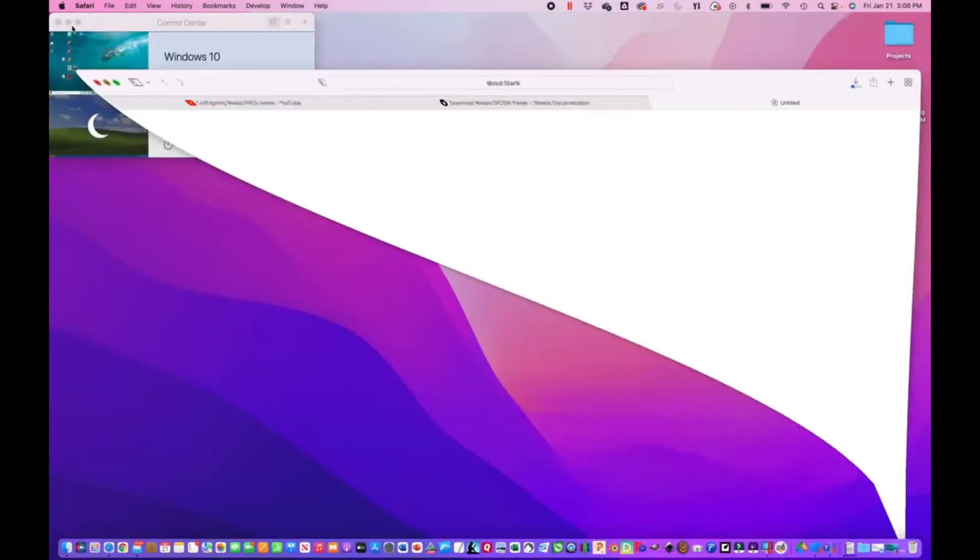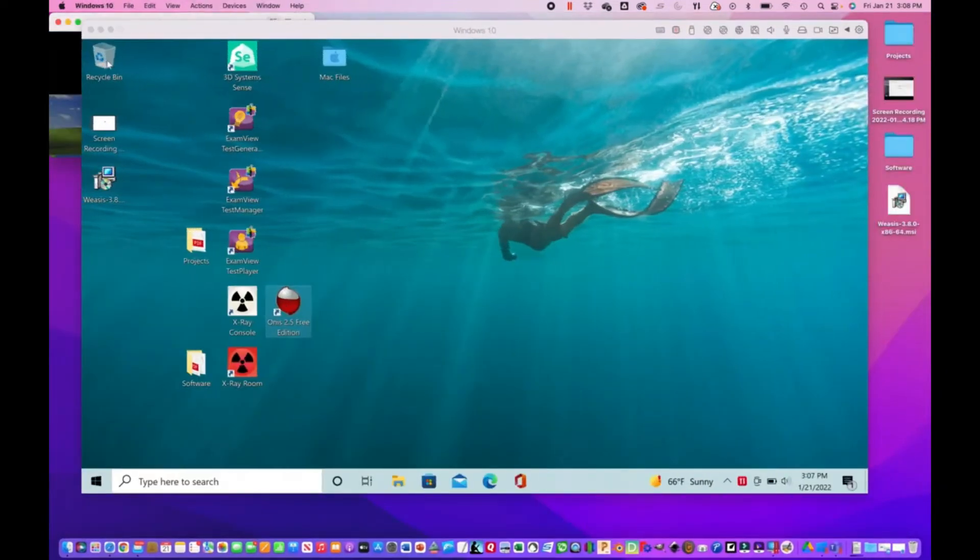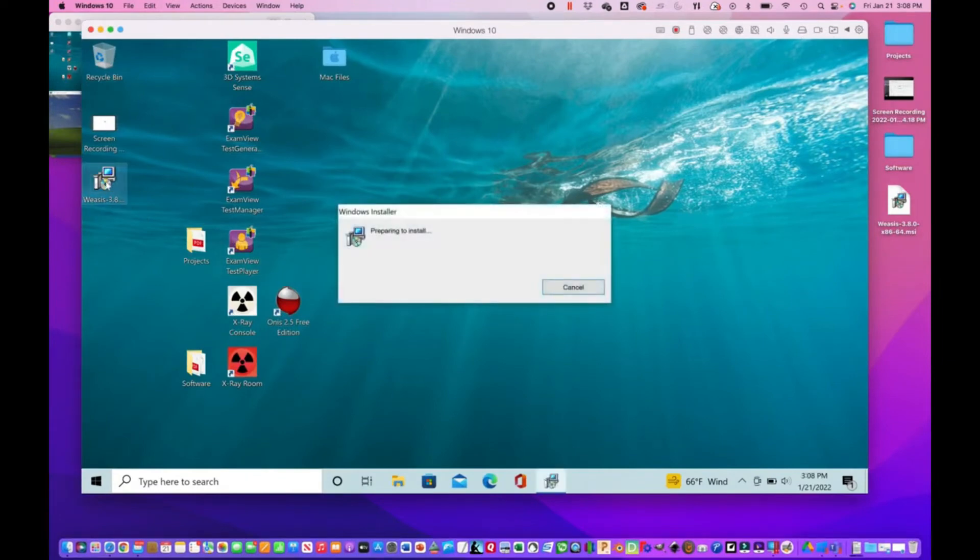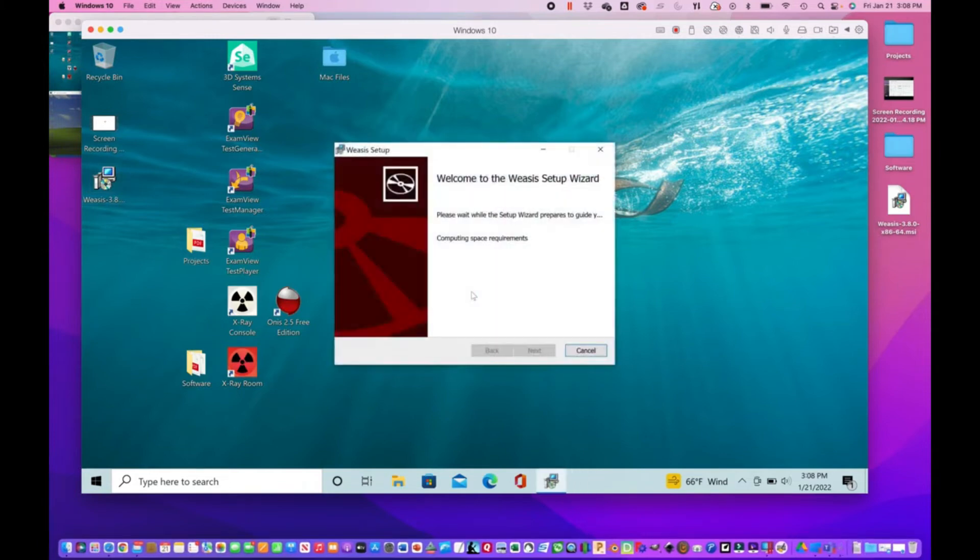Let me just go to Windows here. All right, so here it is, the install package.